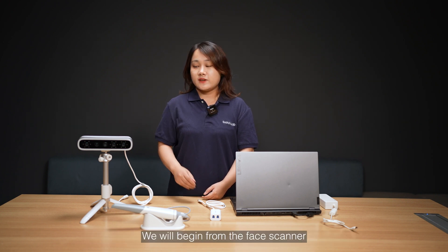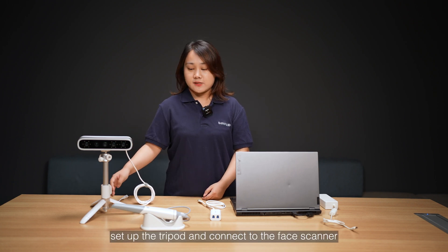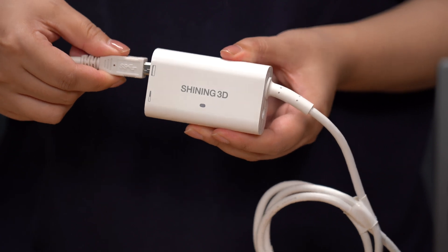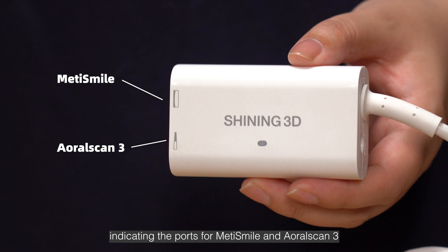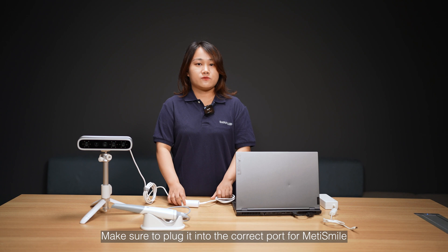We will begin from the face scanner. First, set up the tripod and connect to the face scanner. Then, connect the face scanner to the USB 3.0 repeater. Please note that there are two icons on the repeater, indicating the ports for MetiSmile and Aoralscan 3. Make sure to plug it into the correct port for MetiSmile.